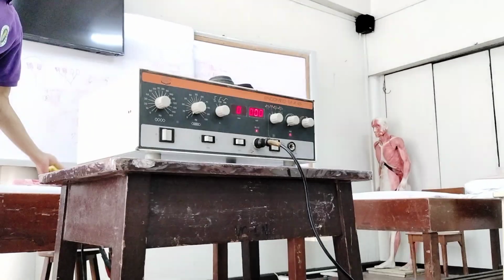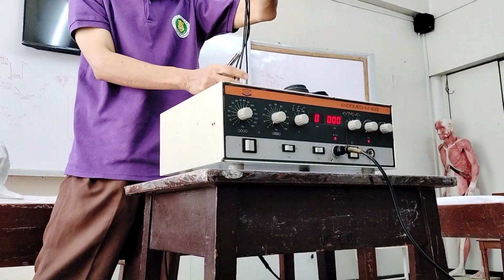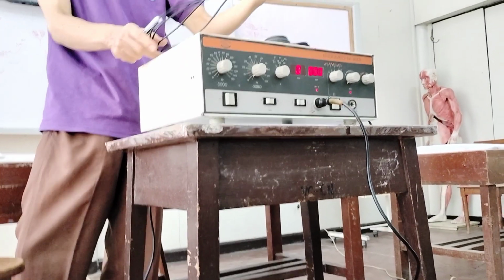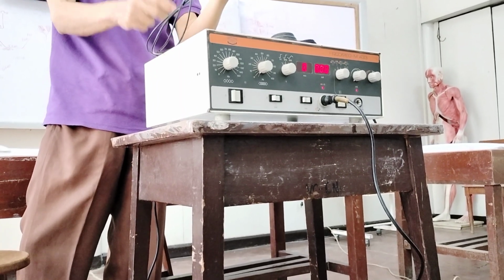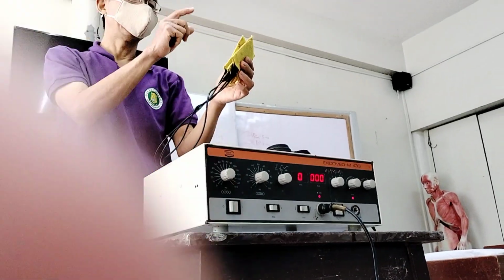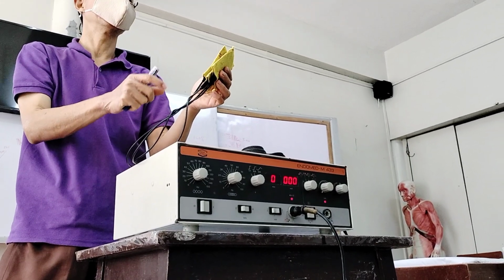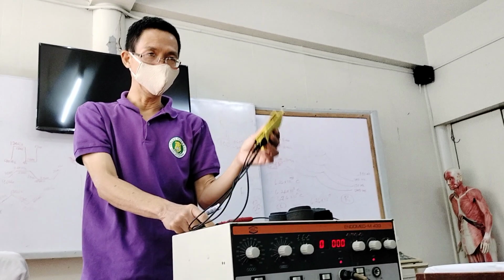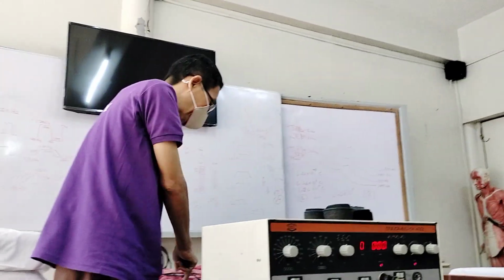One of the concerns or problems with quadripolar is that it's hard to apply the electrodes. It's not easy because you have to apply 4 electrodes. Also, the position of the electrodes should be such that the currents produced intersect or cross each other.